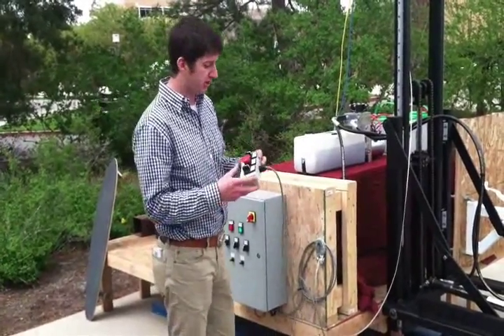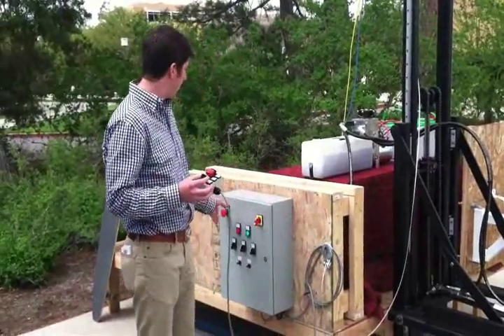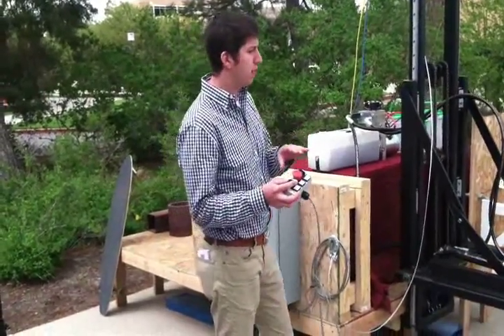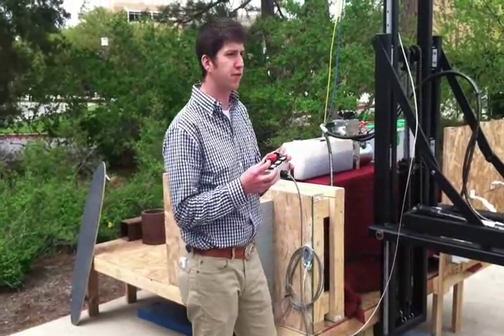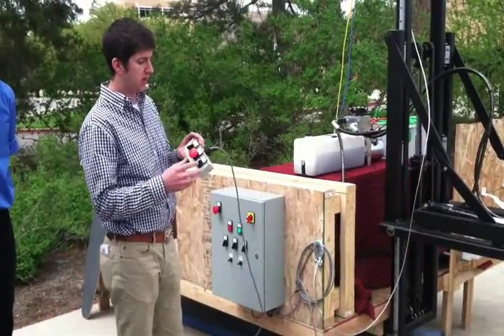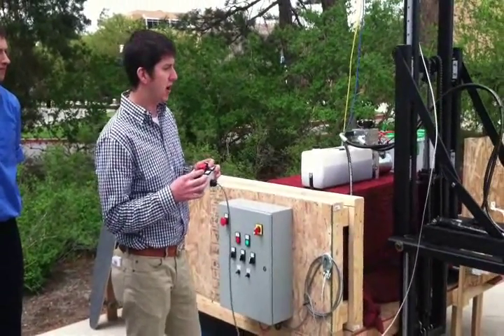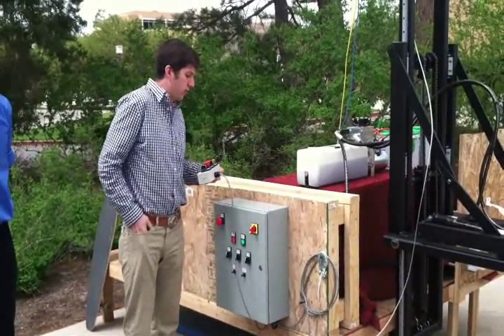I'm going to demonstrate the emergency stop. There's one here and here. If for whatever reason you need to stop while operating, you hit the emergency stop and everything is frozen — nothing works. All you have to do is release the emergency stop and everything operates as it should.